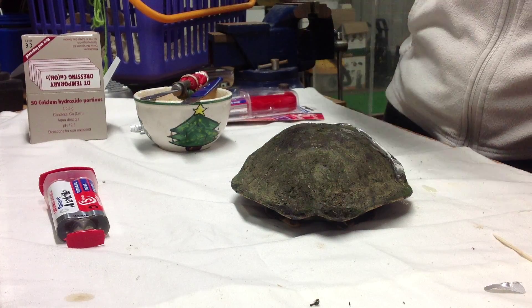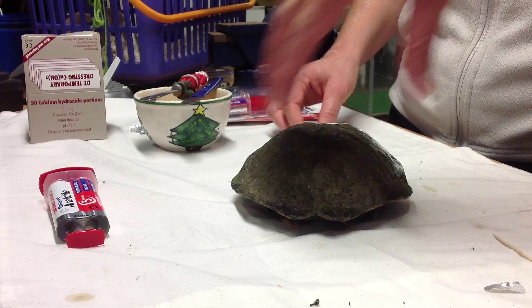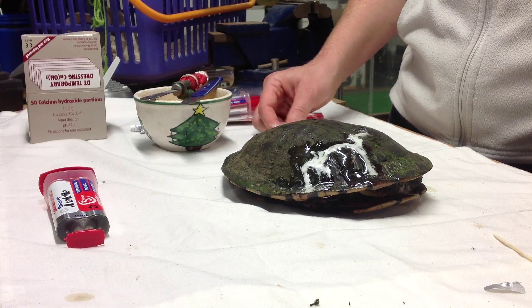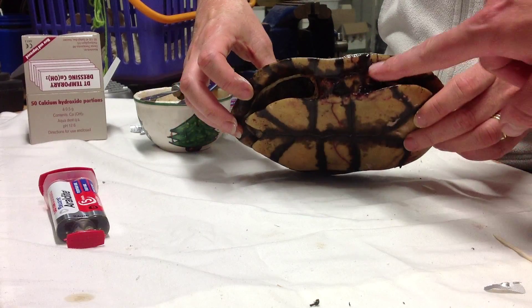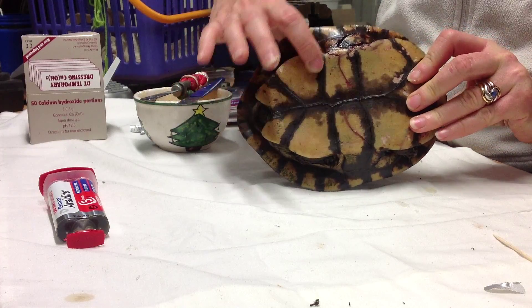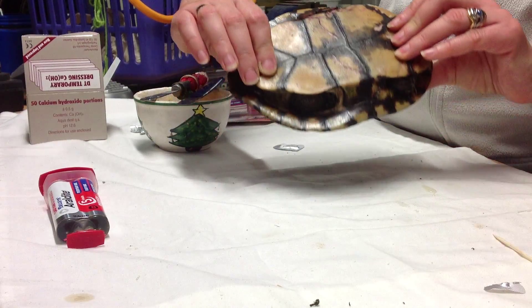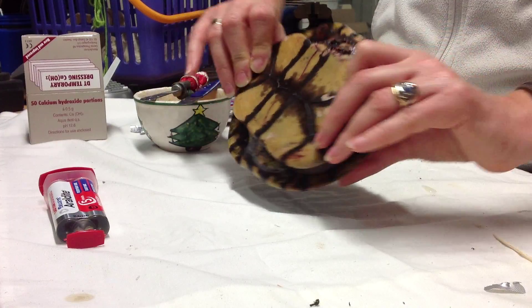It's pretty much touch-dry — the two-pack Araldite on the front of the turtle. So that's sealed up nicely on the top half. We now need to do more or less the same thing for the bridge crack, which we looked at earlier. We'll flip him over and try to get the best angle possible for you and set up this other side.